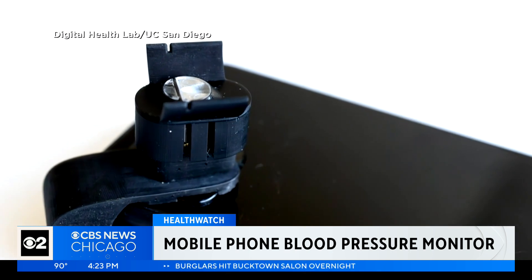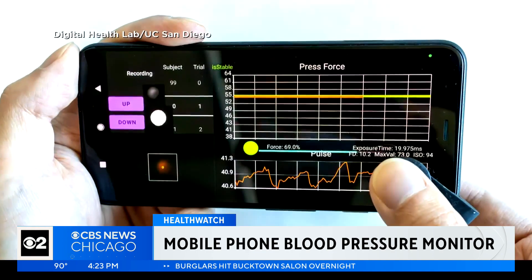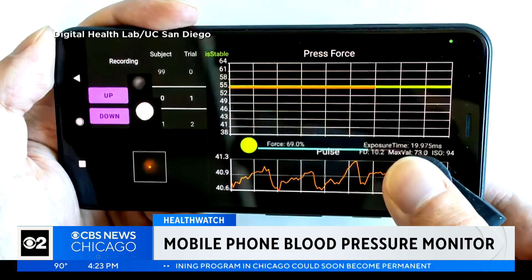The attachment simply gets clipped over the smartphone's camera lens and flash. The user then presses a fingertip down on the clip while a custom phone app guides you to take multiple readings using different amounts of force.